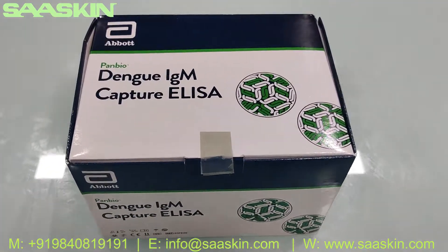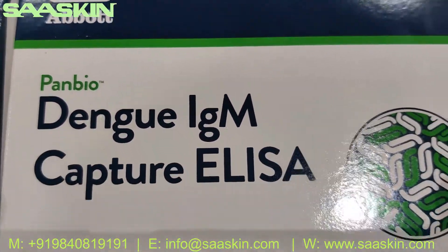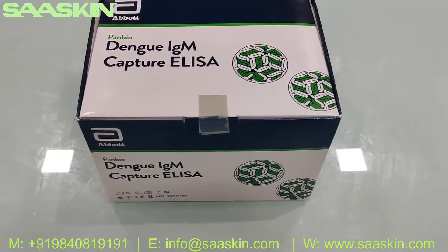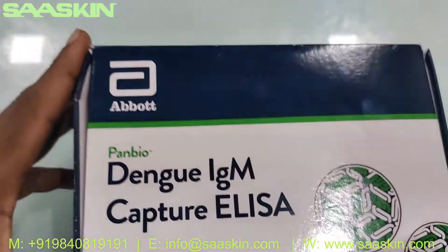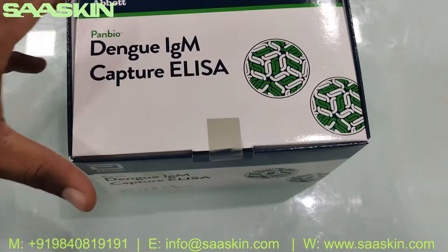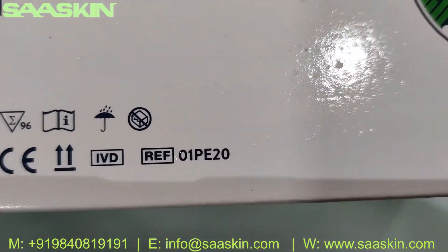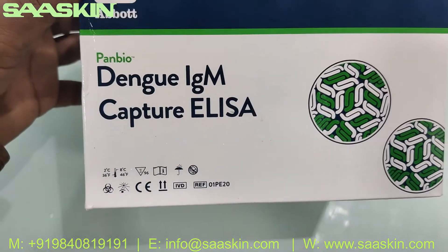Hello everybody, today we're going to look at the Abbott Panbio Dengue IgM Capture ELISA test kit. I'm going to show you the box and also introduce the contents inside the kit. On the front side you can see the part number reference is 01PE20. This is a complete CIBAD certified product.